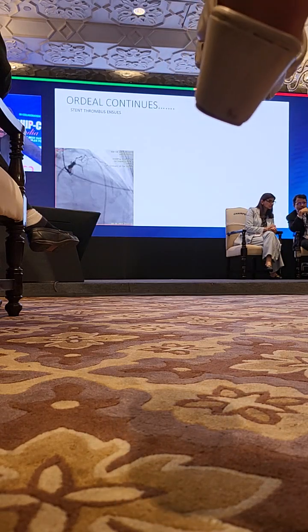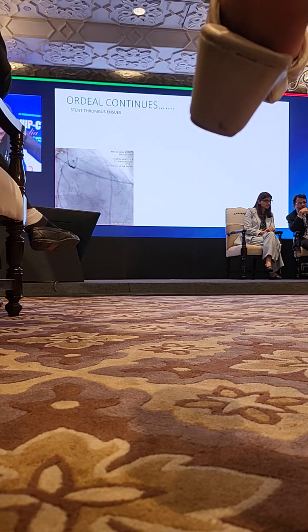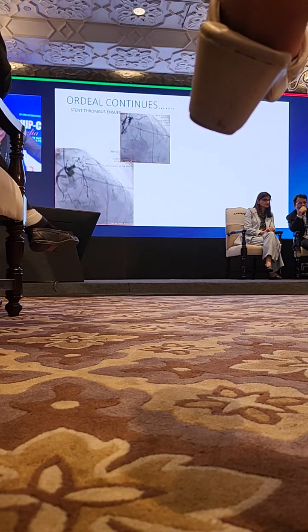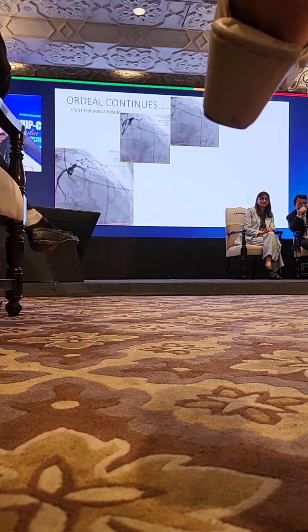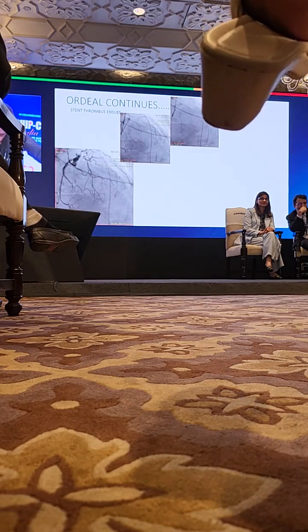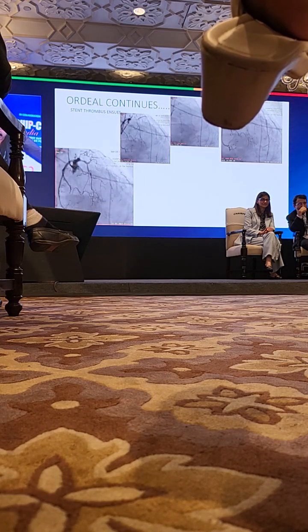After the balloon occlusion was done, that part became okay. But the ordeal continues, because now we could see that the patient had gone into stent thrombosis.